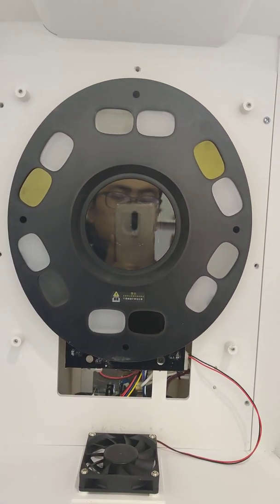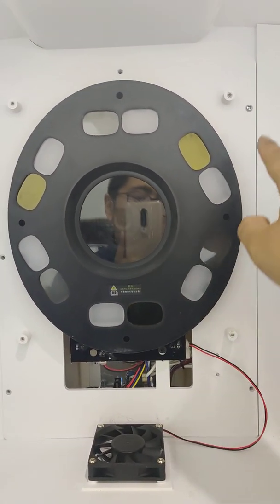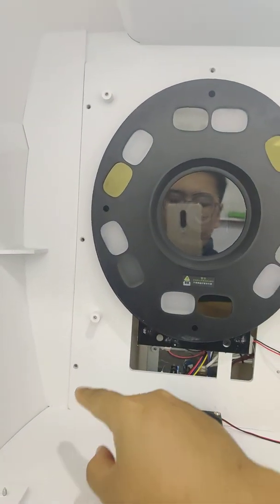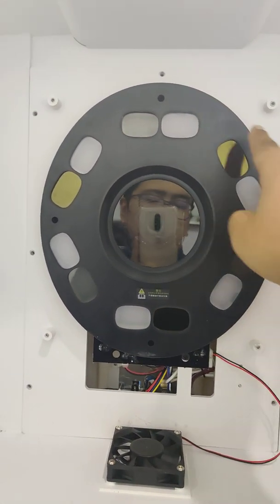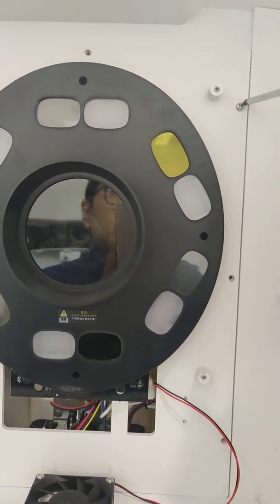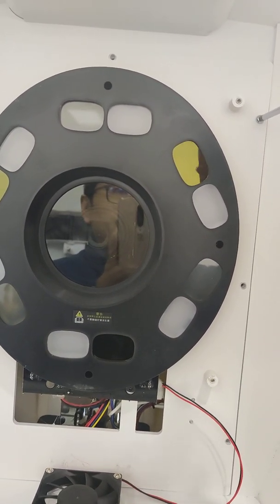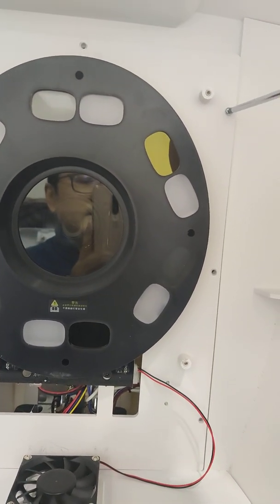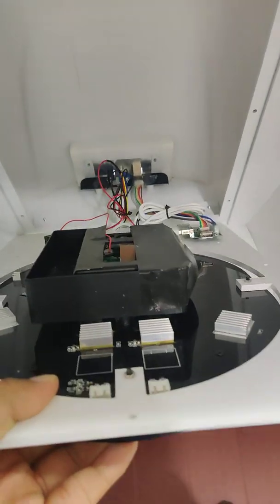Then we can see it's just like this. We need to take off 1, 2, 3, 4, 5, 6, 7. 7 screws. Okay. We take off these screws. We take off the screws. Okay. Like this. Then it will be like this.